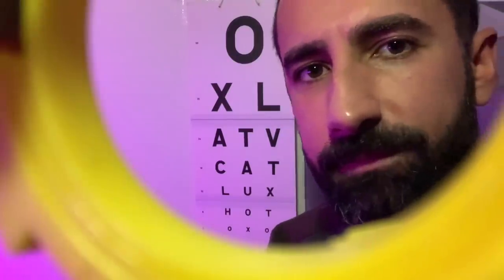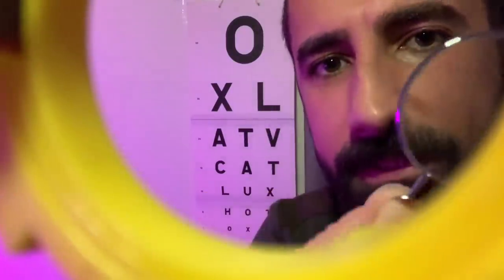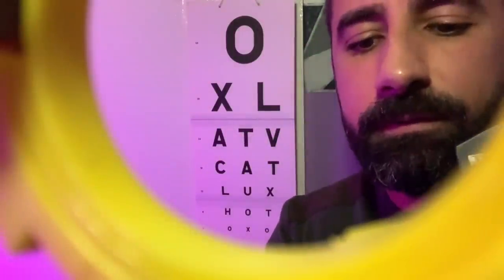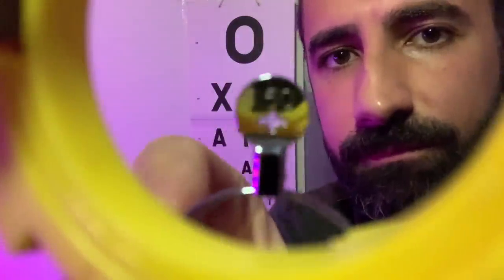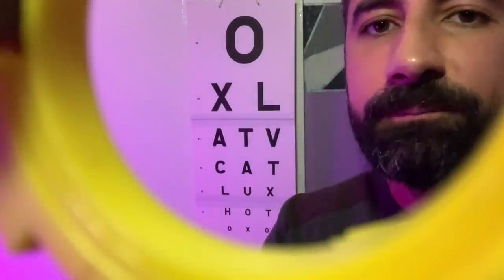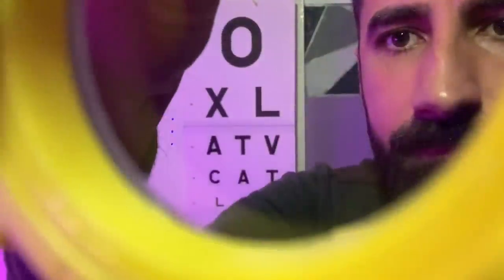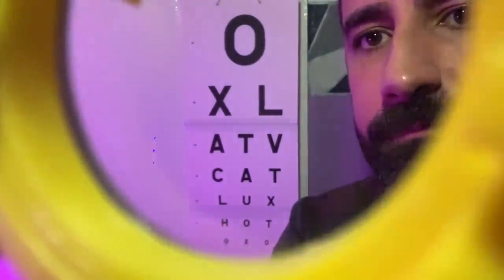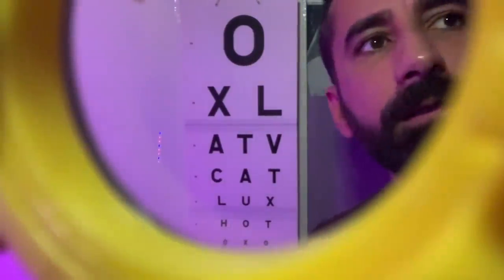Okay, so now that the trial frame is sitting on you comfortably, we need to place a plus 1.5 diopter sphere in place just to do some retinoscopy. So we'll pop this in the trial frame. The vision might go a little bit blurry there. Do not fear.